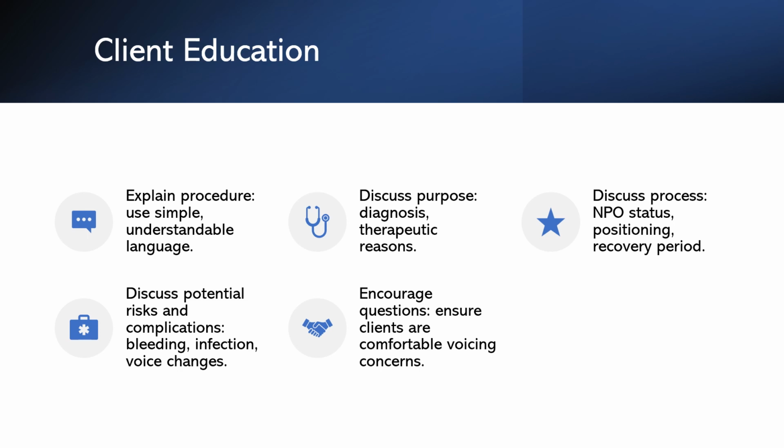We need to explain the procedure in simple, understandable language. They're probably scared and anxious. It's our job to alleviate those fears by providing clear, accurate information. We should explain that it's a procedure that allows the doctor to examine the lungs and airways. It's not a surgery, but there might be a biopsy taken.